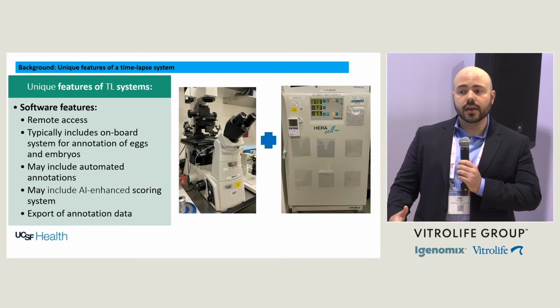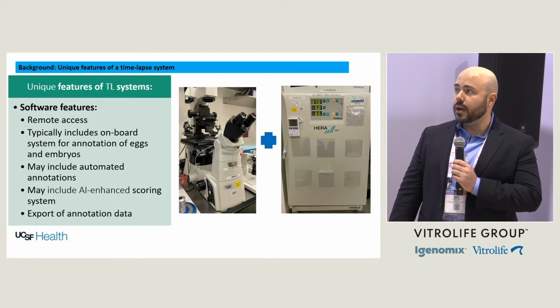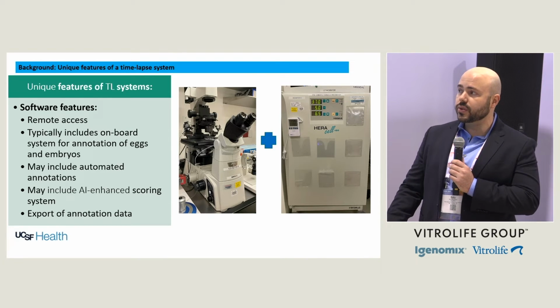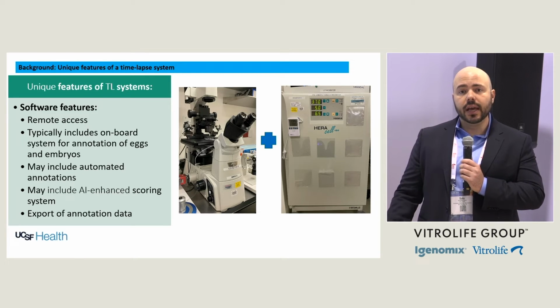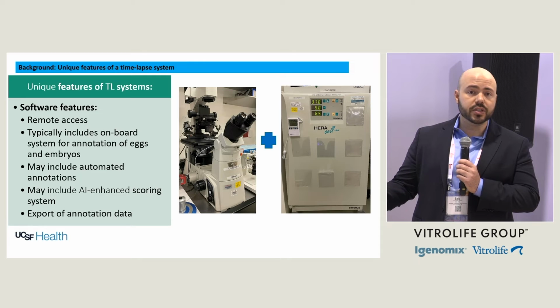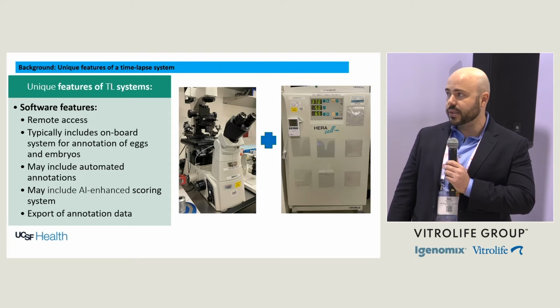During the pandemic, because we're still near the end of the pandemic, embryologists were able to do great assessments from home, something that otherwise we couldn't do before. If you only have one fertilization check to complete, you don't have to go into the lab, but can just visualize the fertilization check online, and because that information is saved, you'll be able to visualize it the next day.